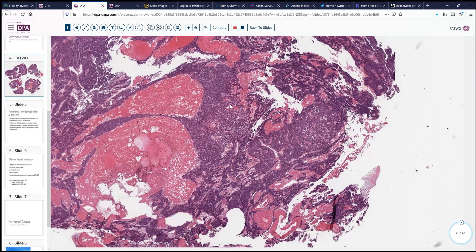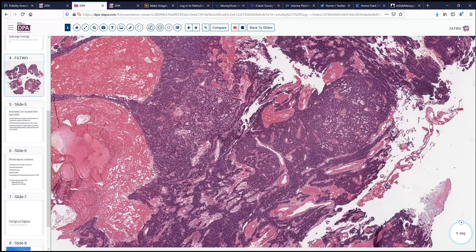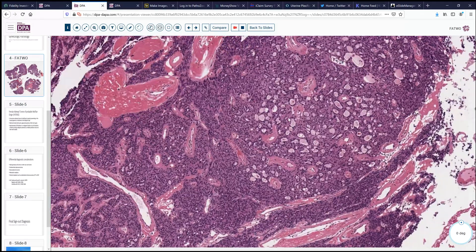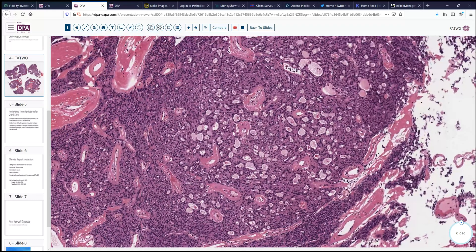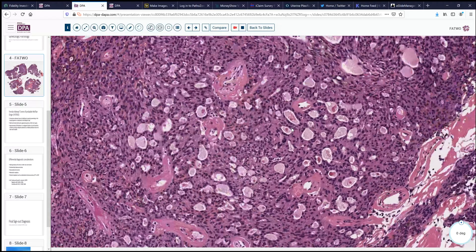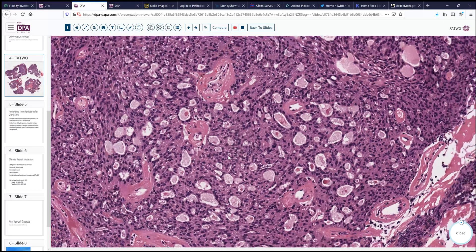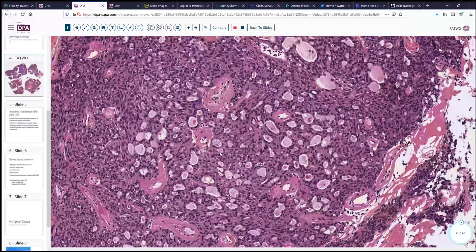One of the features that we can see at low power is these areas, which have a characteristic pattern. We see there are many little small microcystic areas here in what might be termed a sieve-like pattern. The cells lining them do not appear to be usual adenocarcinoma type of cells, because they're really not oriented very well towards the gland or the space, the lumen of the space — rather just a haphazard arrangement of cells and nuclei relative to those spaces.